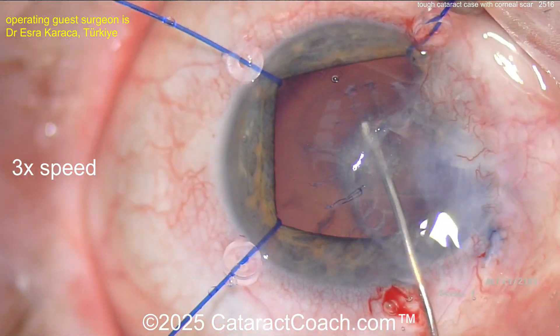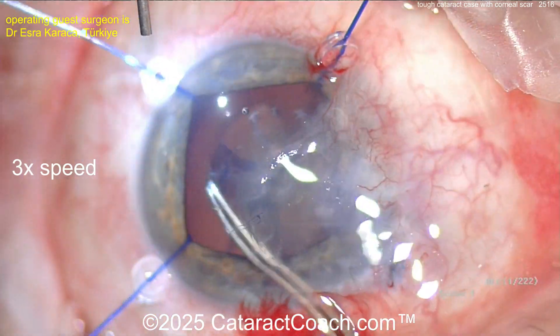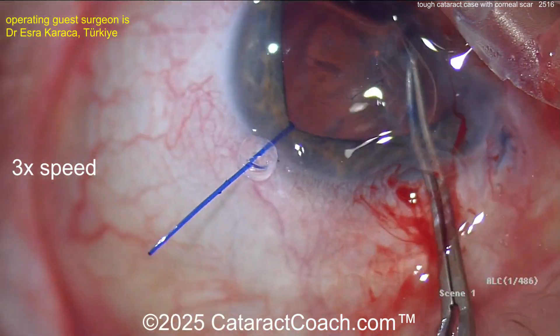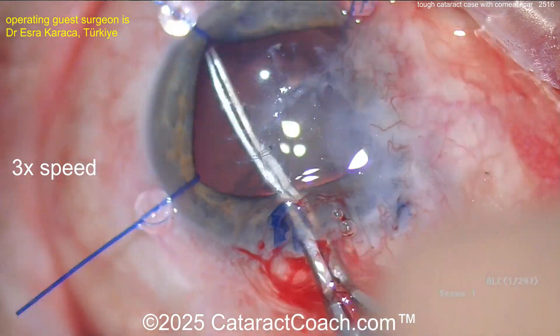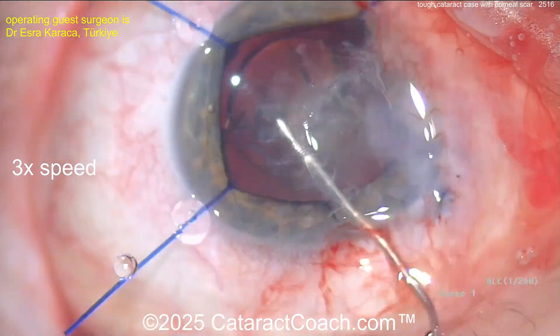How would you do the calculations? Myopia is your friend — it's okay if the patient ends up with a bit of a myopic target. Here the capsulorrhexis is going down. I like the light pipe on the side to give extra illumination, which can be very helpful in a case like this.